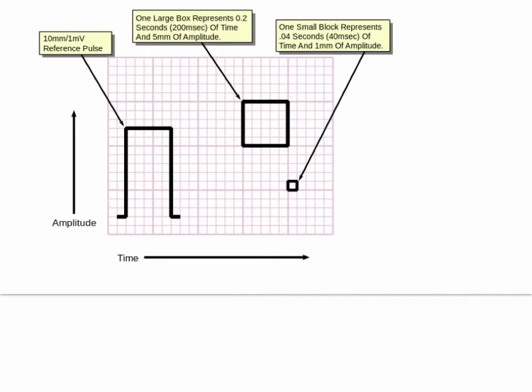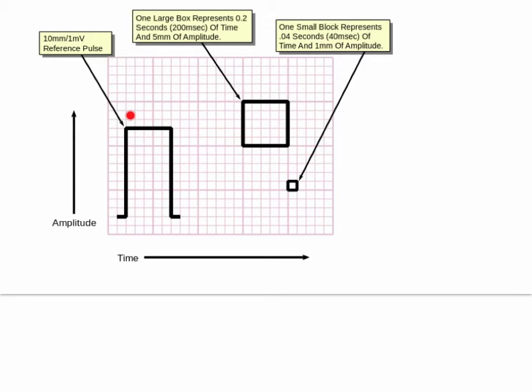On the EKG you'll typically see a reference pulse — it's usually 10 millimeters per 1 millivolt. A 1 millivolt reference pulse is made so you can see exactly what 1 millivolt looks like, and then you compare the lines to that. Each tiny square is 1 millimeter, so there are 5 millimeters in a small group and 10 millimeters between here and here — that's 10 little squares.